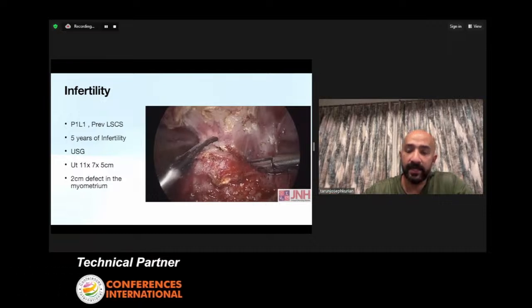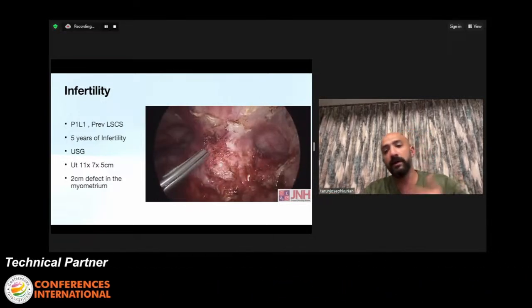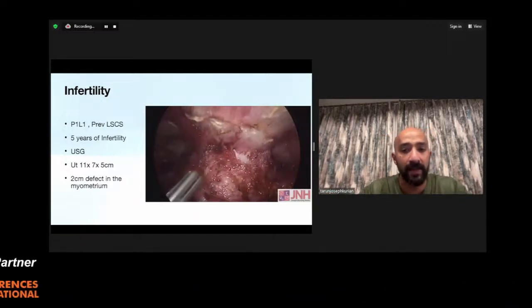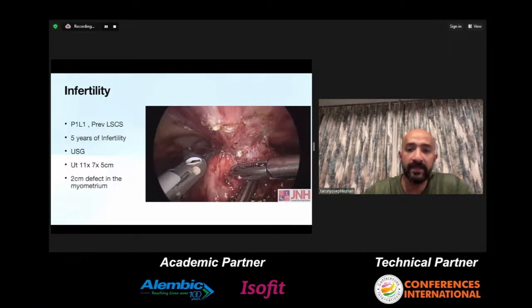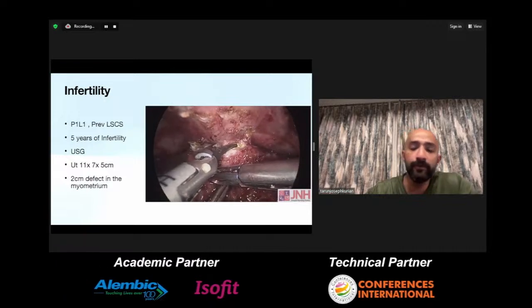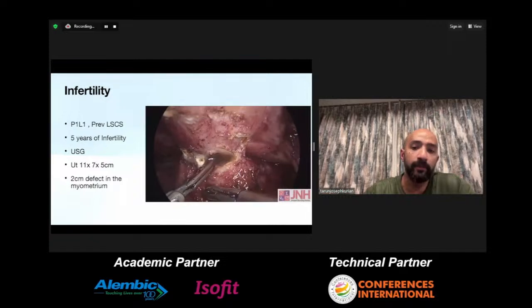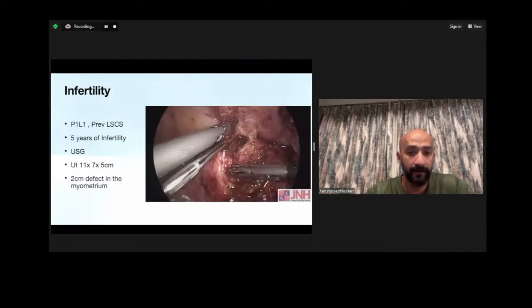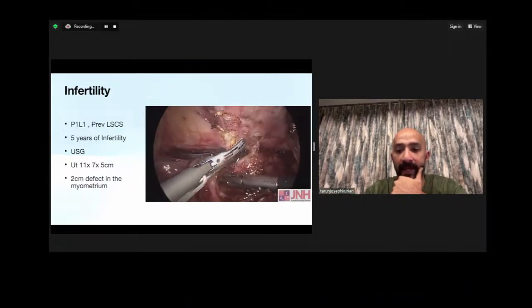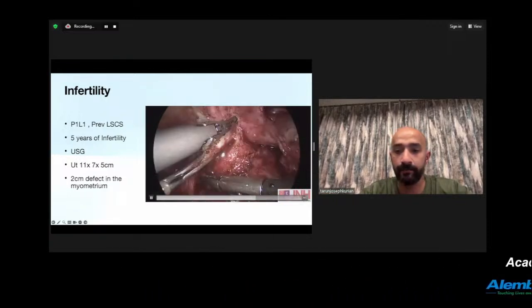So our first step is to get the entire uterus down. Now, most of these uteruses that are stuck above the bladder can be pulled up. In most cases, it is well down, and there is a peritoneal pocket that develops between the bladder and the adhesion. So you can see we're dissecting into what we hope is an avascular plane. If you start to see bleeding while you're doing this dissection, it tells you that you are going into the wrong plane, in which case you could change the direction of the plane. So here, as I was cutting, I entered into a small pouch, initially thinking that was the bladder. But then on further dissection, I found that to be just the peritoneal pouch.